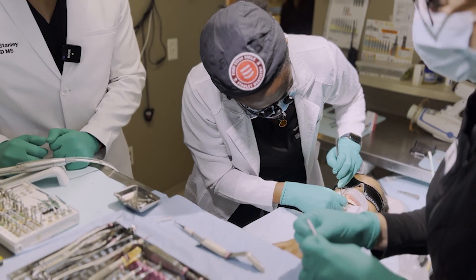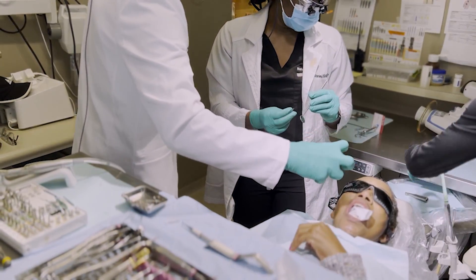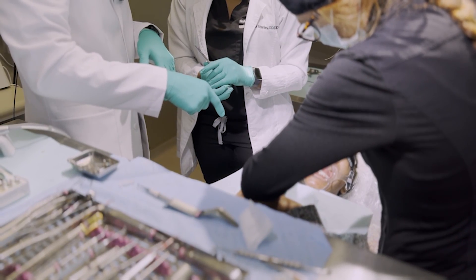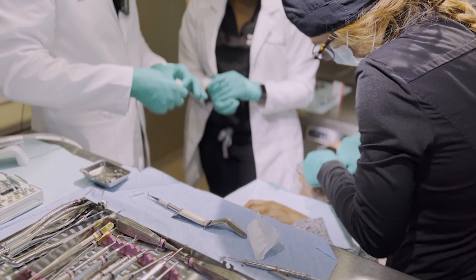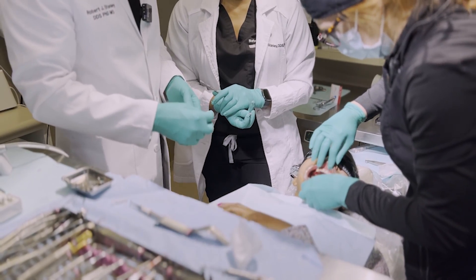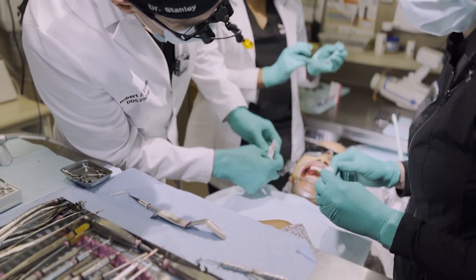The plastic's hurting her. Let's take that out and use the U-shape so she can see. Some people who have nice soft lips — the retractor. When you pull with your mirror or your Minnesota, it won't be in the way. But it's sometimes necessary for certain patients — soft lip patients. She said voluptuous. Yeah, that's a compliment, honestly.